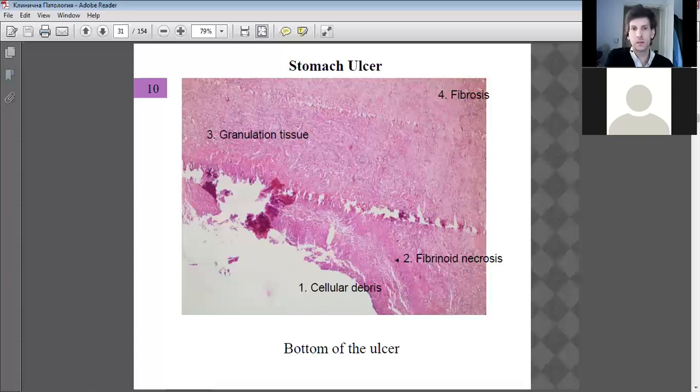Okay. Any other questions? There's like a white line sort of streaking across the middle. This one. Is that of any significance? Oh, the one below it.